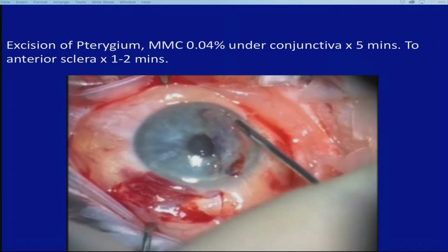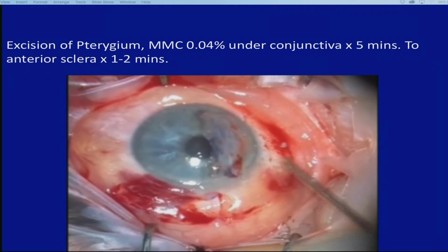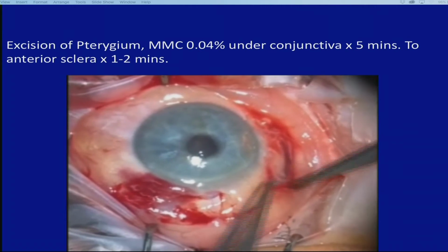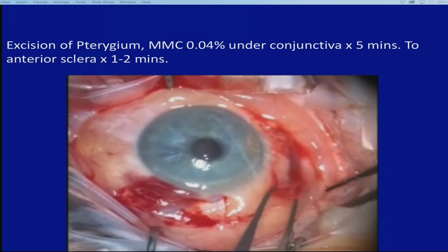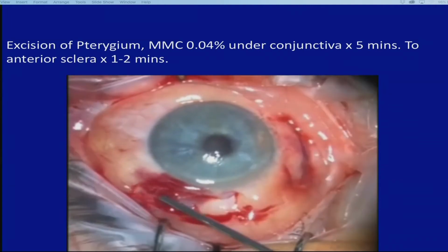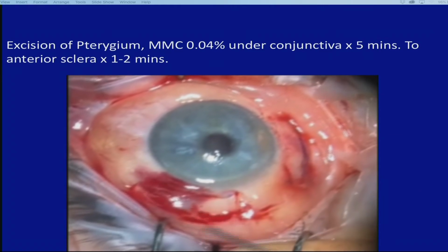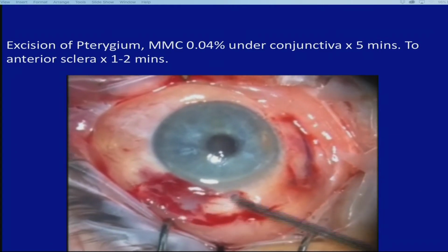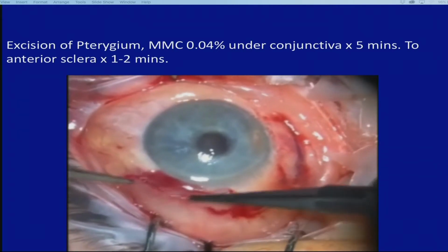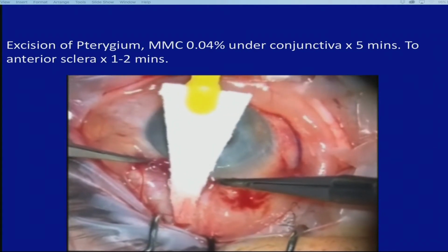So we put the thick part of the glue on the back of the conjunctival graft and the thin in the bed, and then with two tying forceps we move the conjunctival graft to the bed and make sure we stick it also to the remaining host conjunctiva. We can still use fibrin glue to glue also the area where we've taken the autoconjunctival graft, and with this technique there are no sutures, there is no time spent removing sutures, much less irritation from the needles and the suture, and much less recurrence.